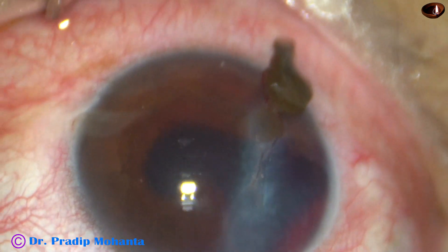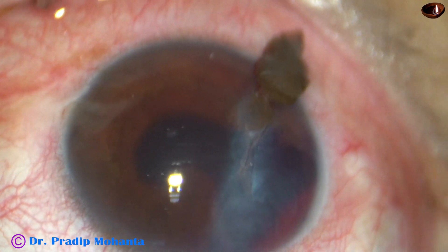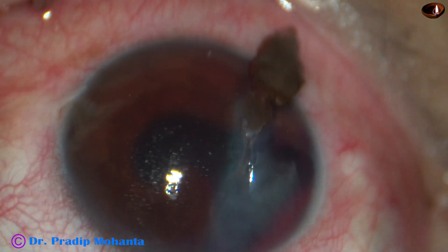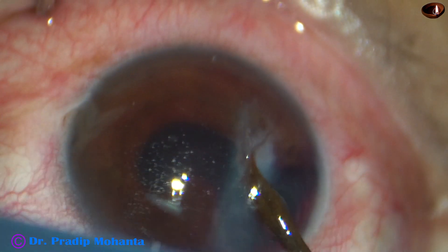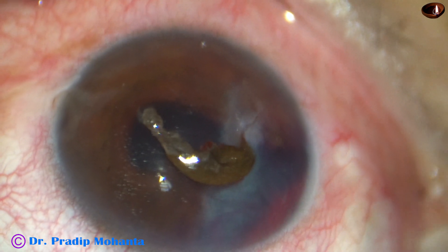And now we can see that there is iris prolapse. We have been taught that prolapsed iris is contaminated by microorganisms. So we should not reposite this iris into the anterior chamber. We should excise this iris.